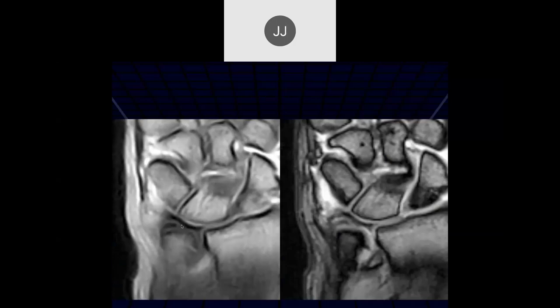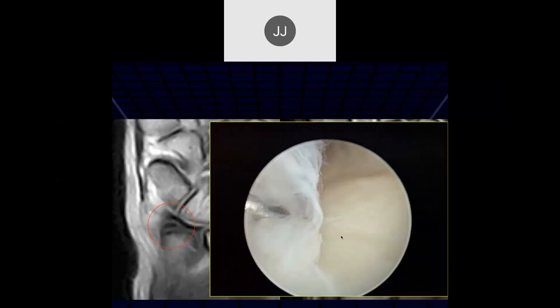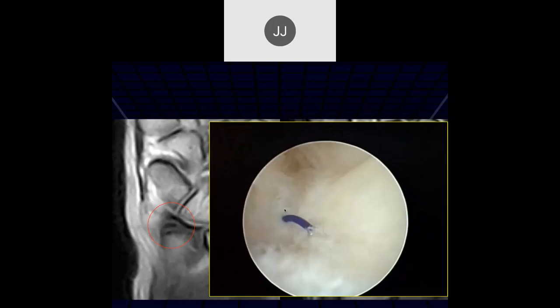Here we can see an oblique tear of the periphery of the triangular fibrocartilage. This patient was not imaged in the proper position, so we don't see the ulnar styloid. You have to be very concerned when evaluating these cases if they're not positioned properly. We called the tear, and when they went arthroscopically there's the tear — there's the probe going into the tear — and they sutured it in place.